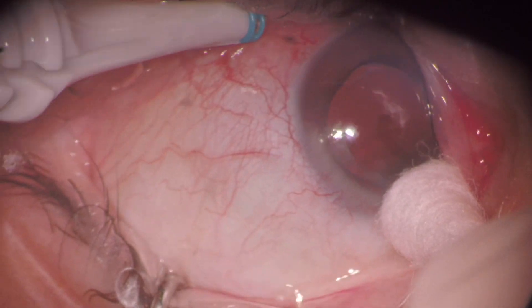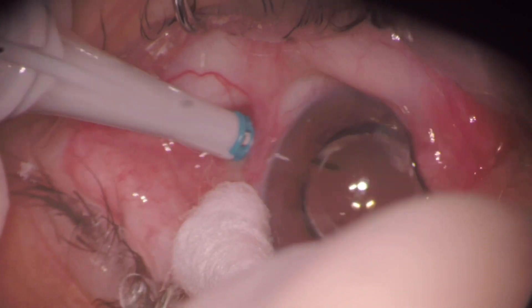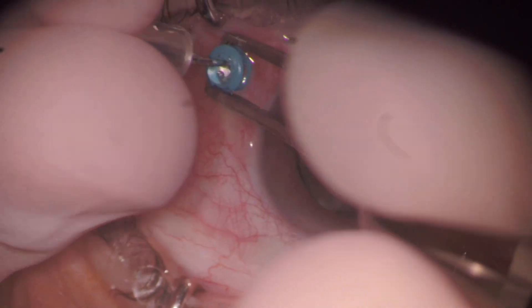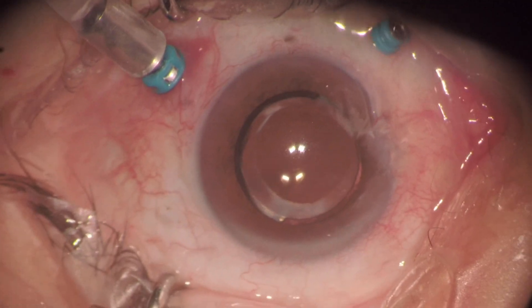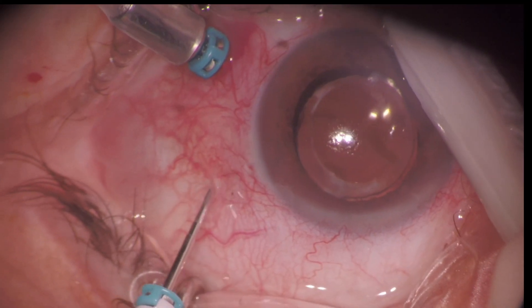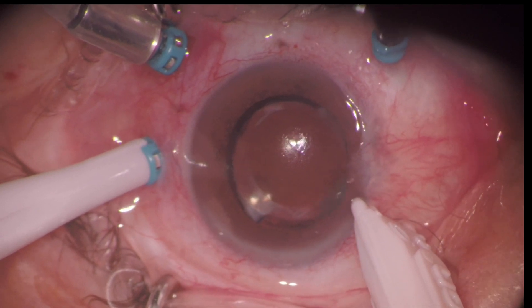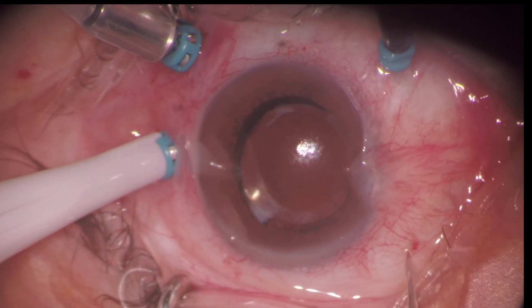This is a case of a 63-year-old male patient with vitreous hemorrhage secondary to diabetic retinopathy. The patient was pseudophakic and had already undergone pan-retinal photocoagulation in both eyes. The procedure indicated was 25-gauge pars plana vitrectomy assisted by chandelier light.